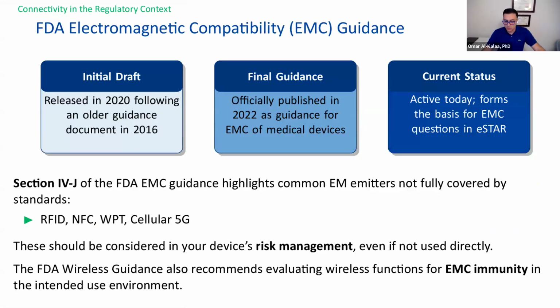Moving on, I want to do a quick mention of the FDA EMC guidance, or electromagnetic compatibility. This is a relatively recent guidance, even though the topic of EMC has for very long been considered by FDA in basically all types of device submissions. The initial draft of the guidance was released in 2020. And then the official version was released in 2022. It is active today. Again, similar to the wireless guidance, it forms the basis for the EMC section in eSTAR.